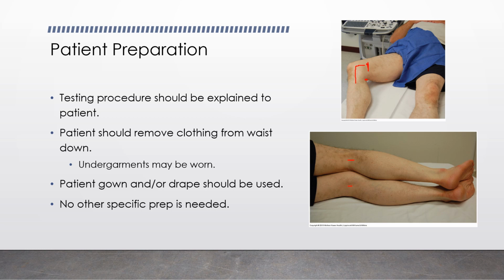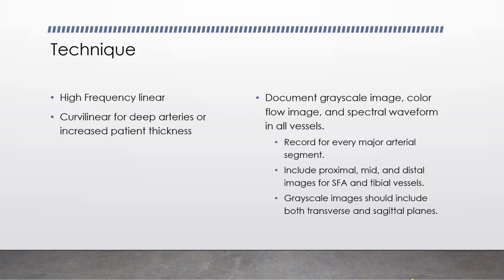Make sure that they're removing all the clothes from the waist down. If they have underwear or shorts on like this, and they can be pulled up above the crease in their groin, then those would probably be acceptable. So you wouldn't have to have them change all the way. Okay. It is important to try and keep the leg you're not scanning covered so as to keep it warm and promote better flow if you are to move to that extremity next.